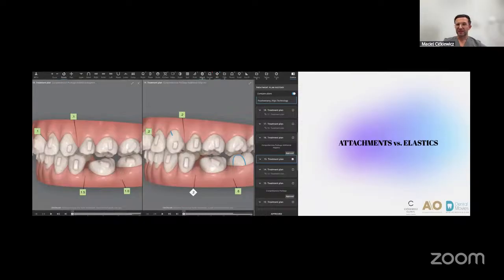Another element here is the idea, if you have this element of putting in the new phase, like with the elastics, so not only attachments appear, but you want to bring the elastics. So the elastics appear here, so you have the incision, and you have the cutout, which you didn't have before.